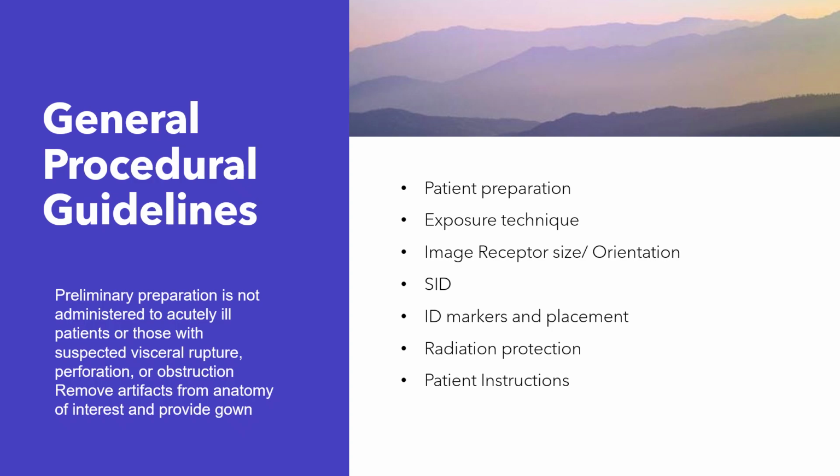All right, moving on. So your patient preparation, in most cases, you are going to have your patient change into a gown free of any metal. Okay? If they have pants on, they have to take them off. I say this every year. People can't believe that you have to specify this, but you have to specify. You're going to learn real quick.